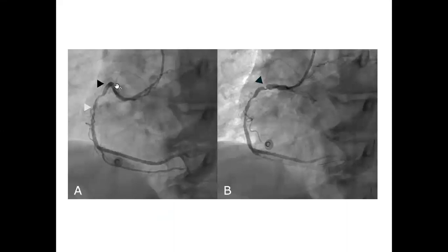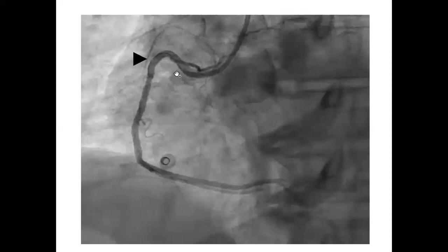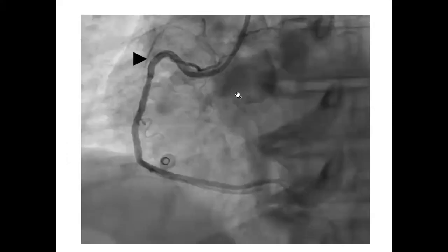Here is another patient — you can see the right coronary artery is a tortuous vessel and the mid segment appears completely diseased. When the wire was put in, the tortuosity straightened and a lesion appeared that was actually due to stretching and invagination of the tissue, not a true lesion. After the stent was placed and the wire removed, the disappearance of the concertina effect can be seen.